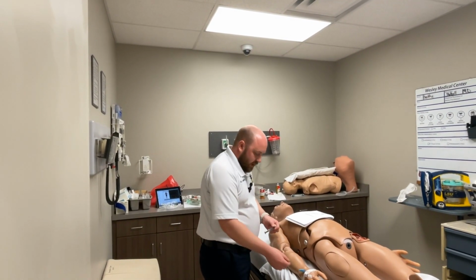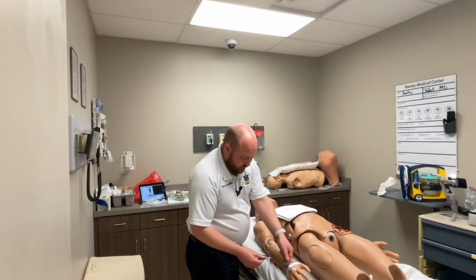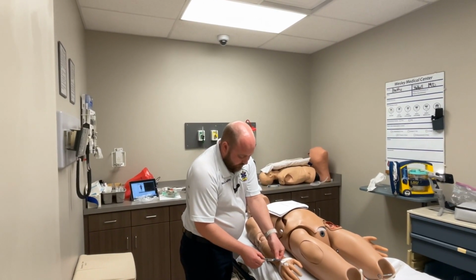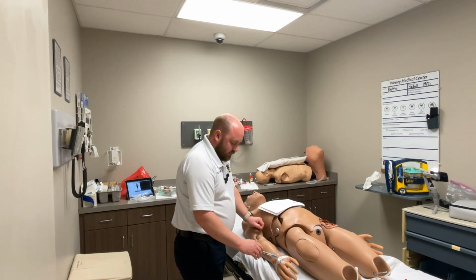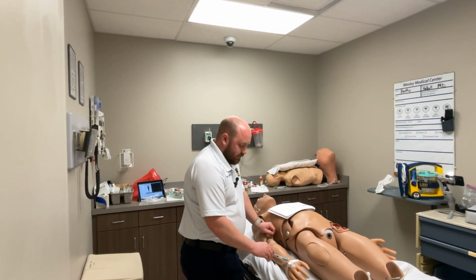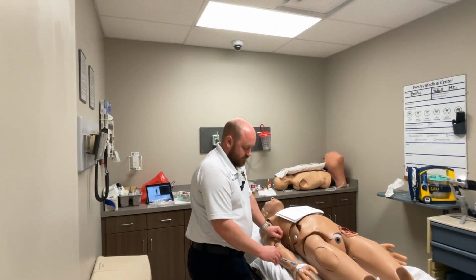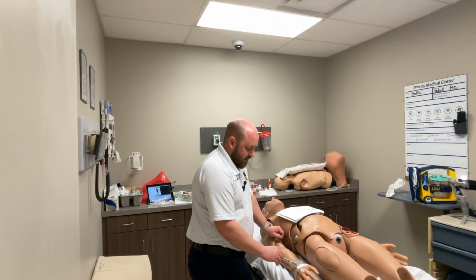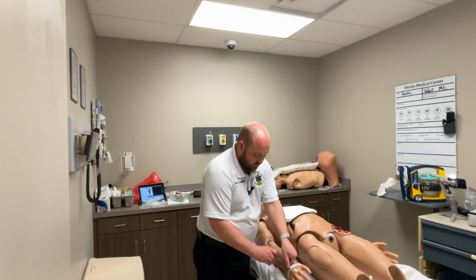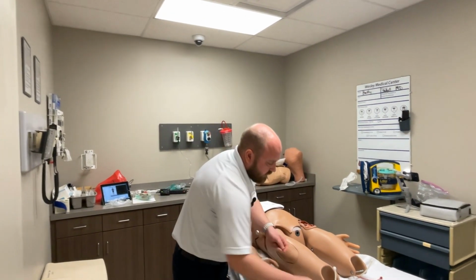Go ahead and wipe the top of your cap right there with an alcohol swab. Screw it on and then push it slowly. And you verbalize that you're going to push this over 2 to 3 minutes. For time's sake, we're going to go a little bit faster. Get a flush.